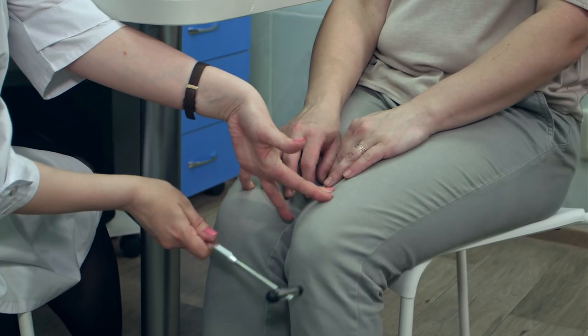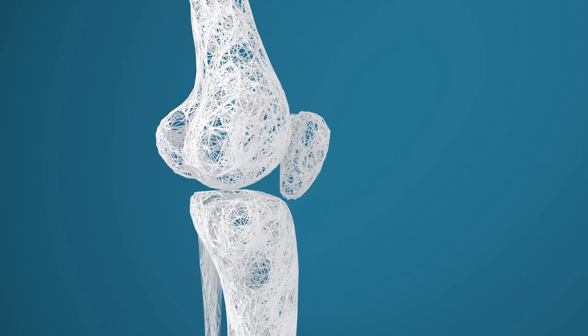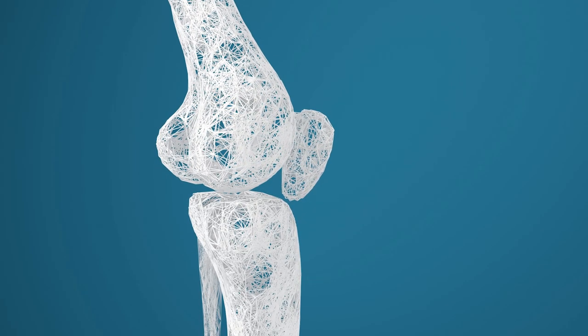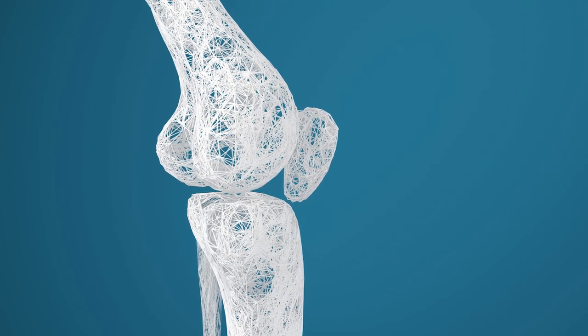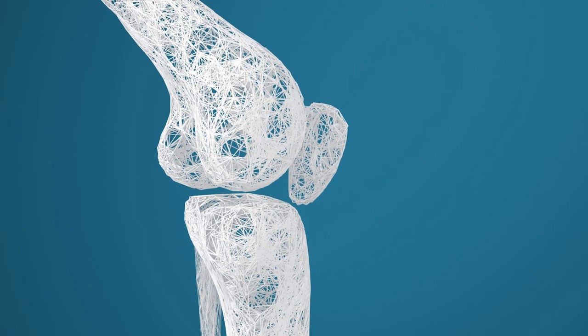The one that most people will recognise is the patella reflex in the knee. We use a tendon hammer to strike the patella tendon, which connects to the patella — the raised knobbly bone that forms the lump of our knee — and the tibia, the large bone in the lower leg.